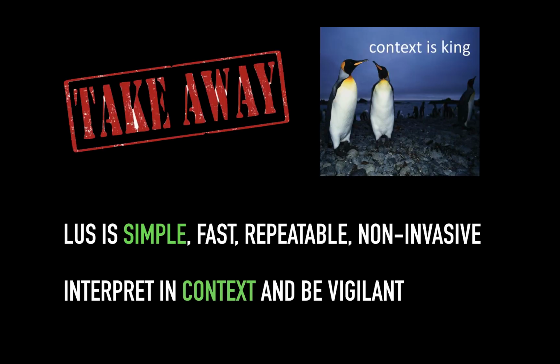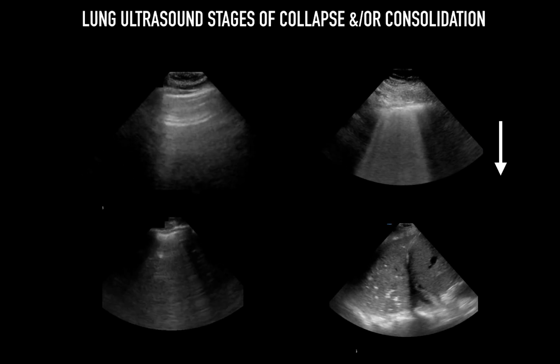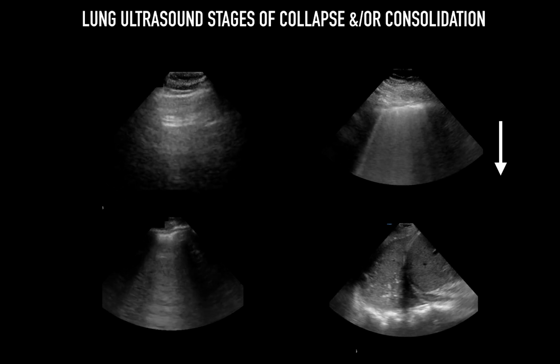In summary, lung ultrasound is simple, fast, repeatable, and non-invasive, but you have to interpret everything in context and be quite vigilant. In this tutorial, we have explored different presentations of interstitial lung patterns as well as consolidation.